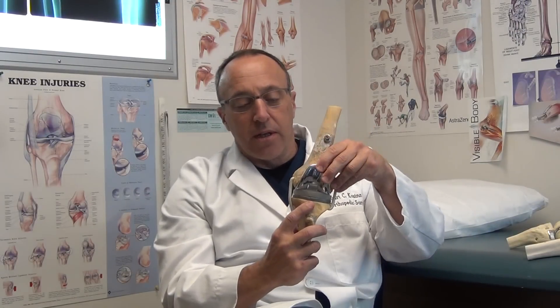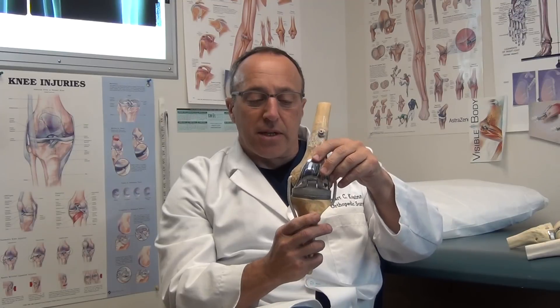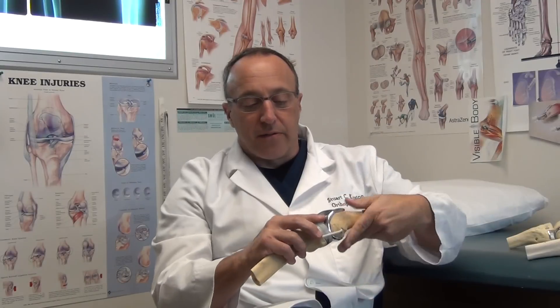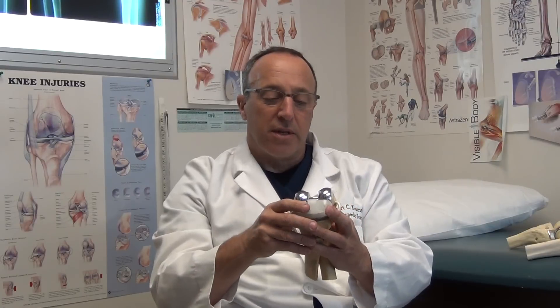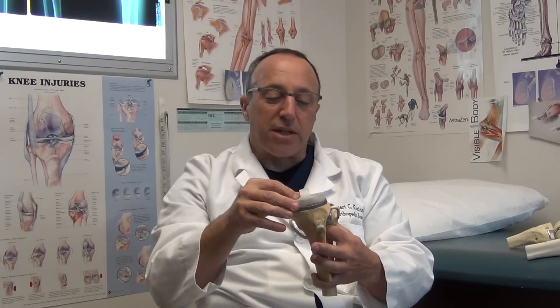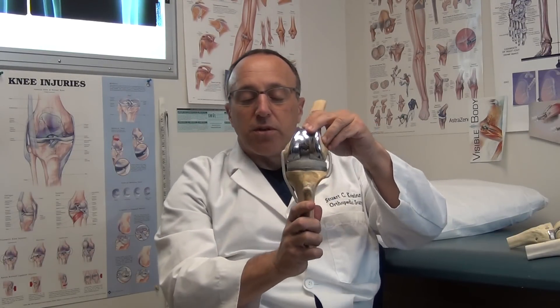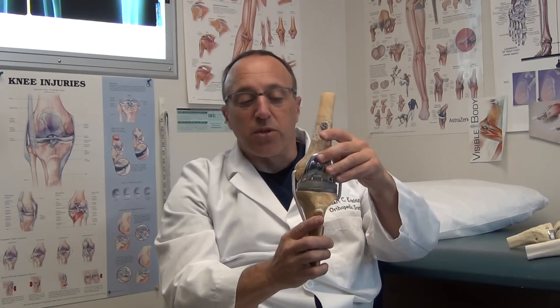The standard total knee replaces the arthritic joint with a hinge-type mechanism that flexes and extends. The standard total joint doesn't rotate. The device involves a metal cap, which is cemented on the end of the femur bone, a metal tray, which is cemented into the tibia bone, and a plastic liner that is basically the shock absorber, which completes the knee. There is a small plastic button that goes behind your kneecap as well.